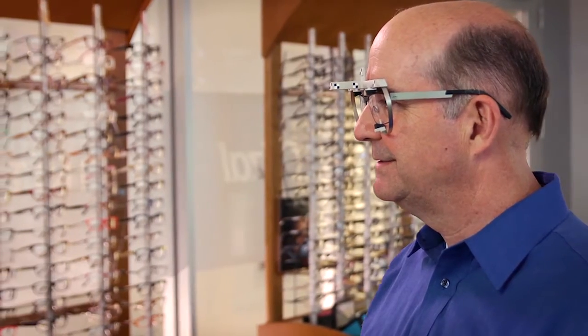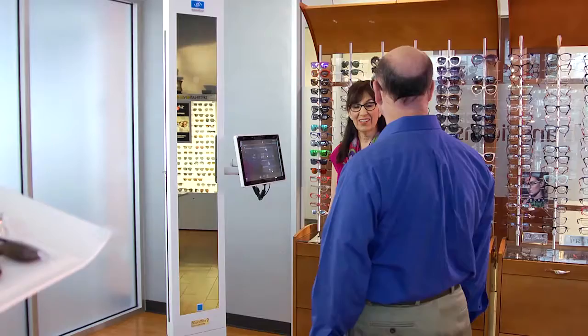Since we're ordering one of our most advanced, personalized, progressive lenses for you, we're going to take another measurement. But you can wear your own prescription lenses for this, okay?